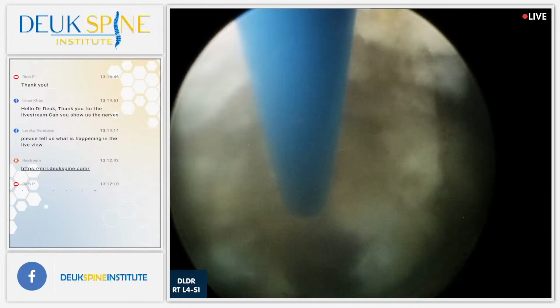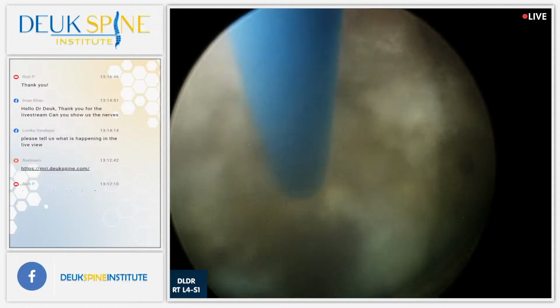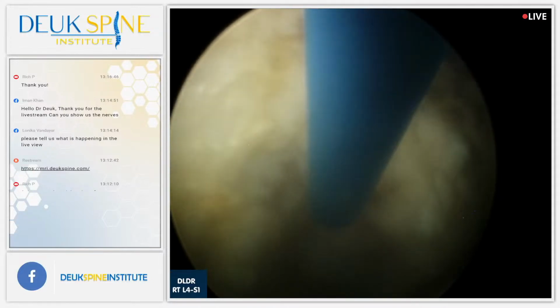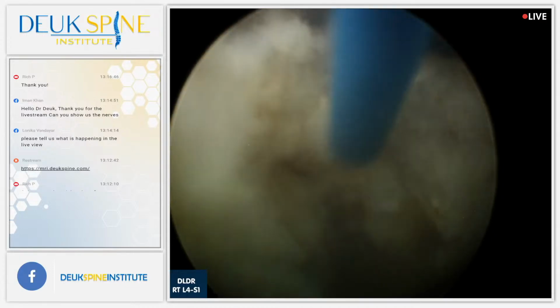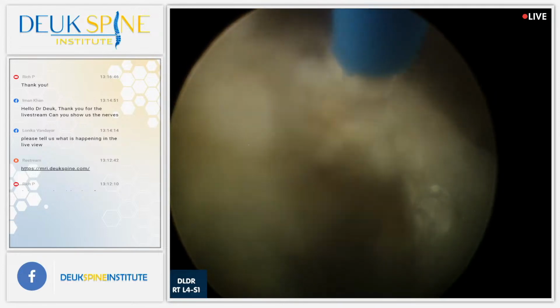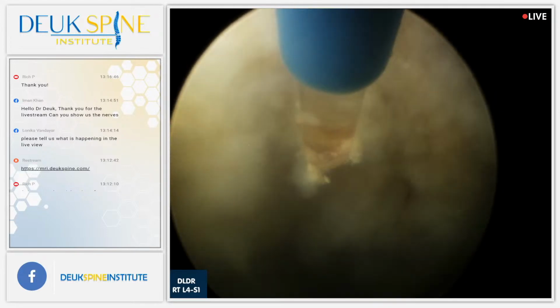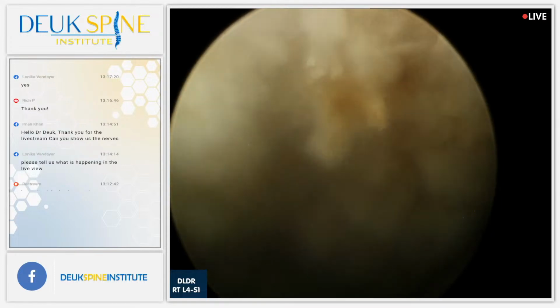Any questions for me? This next question comes from, forgive me if I'm mispronouncing this, Lonika on Facebook. Hello, Lonika on Facebook. Welcome. Asking, please tell us what is happening in the live view. There's a laser right there, the blue thing, and there's a glass fiber coming out of the blue, which is a protective coating of plastic, and the laser fiber is clear and made out of glass.